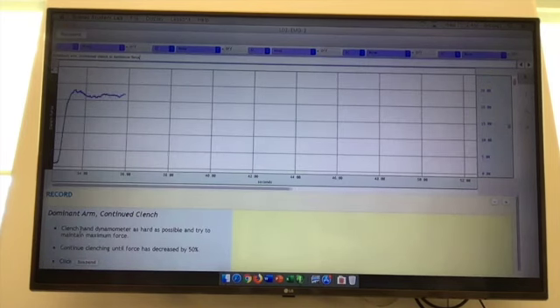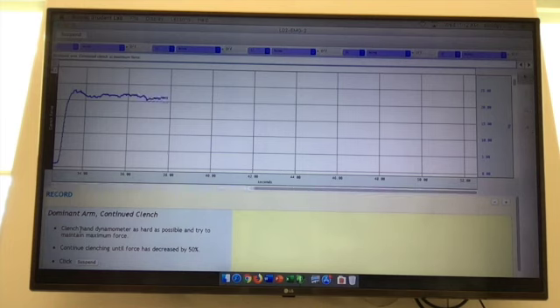So you can see that their force started right around 23 or so. So they're going to try to hold it until it gets down to 11 or 12. So this is a fatigue exercise. We want to see how long they can hold and sustain this movement.